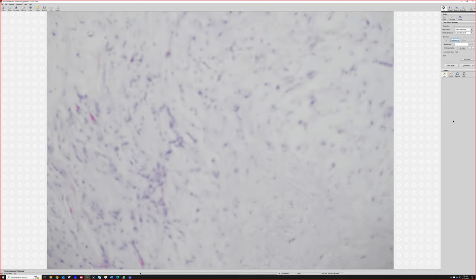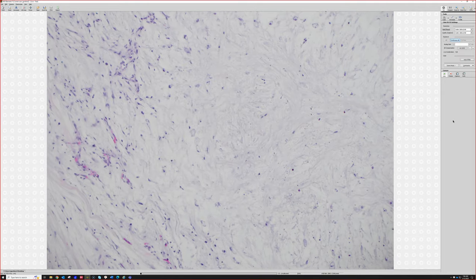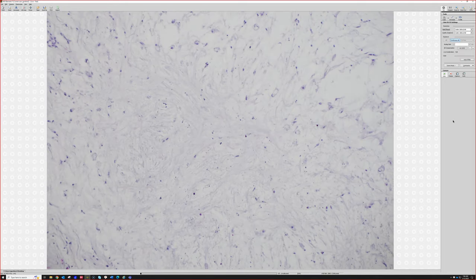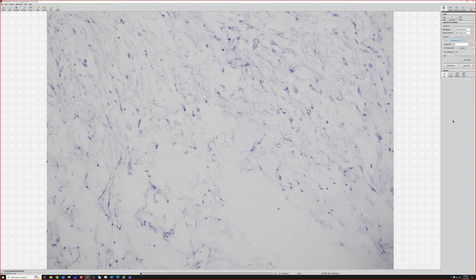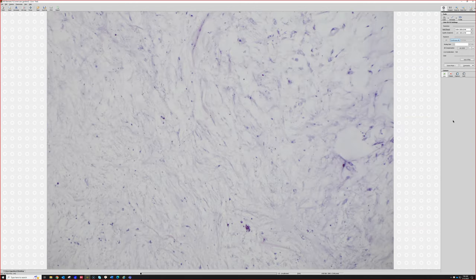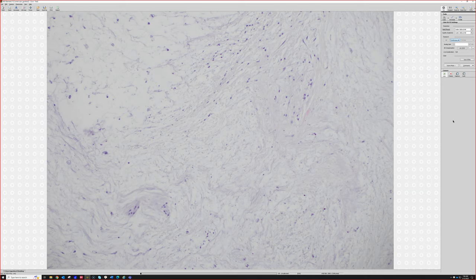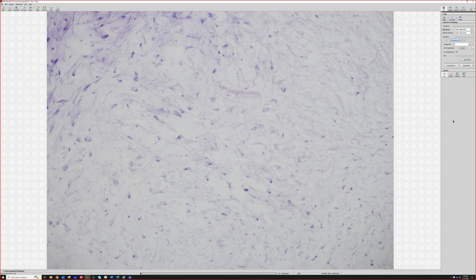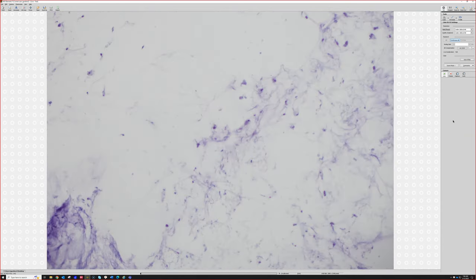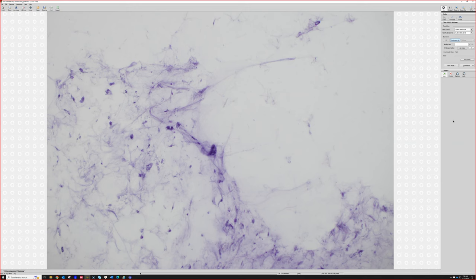This is a little hard because the lighting on these is always hard to get, and also slides fade very quickly with this. But see, the background is pale blue. Is that coming across? Can you see that a little bit? It's myxoid. So myxoid is hard on light microscope to project because it washes out and it's hard with the white balancing. So sometimes it looks blue, sometimes it looks like white. But basically, we've got a nodule that's myxoid or mucinous. And then it's got some little bland spindle cells floating in it. No atypia. Some small blood vessels here and there. That looks like atypia, it's just a blob of the myxoid stuff.